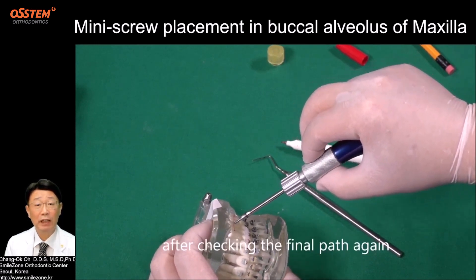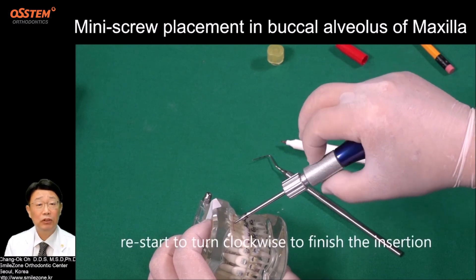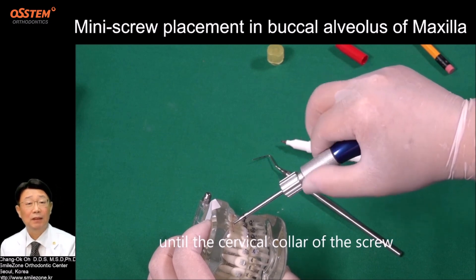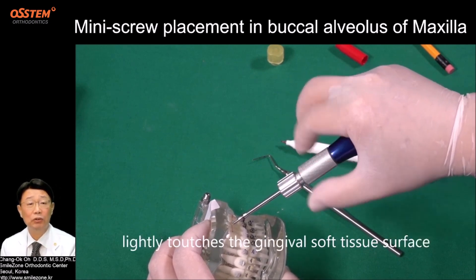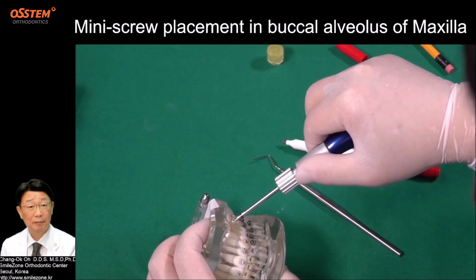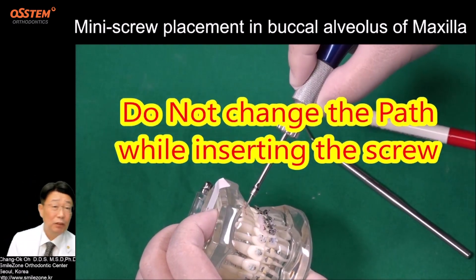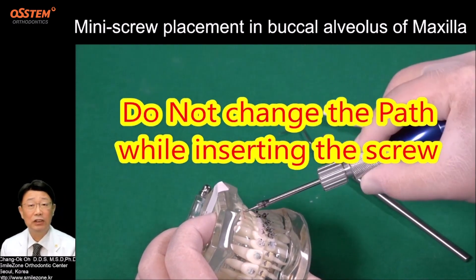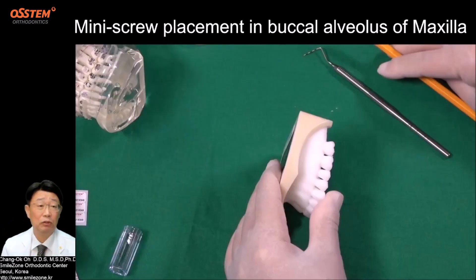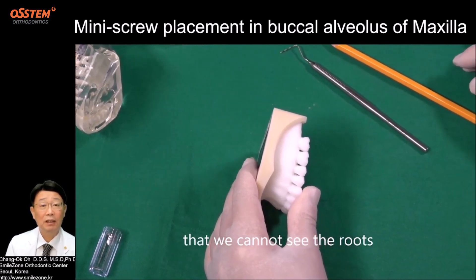After checking the final path again, restart turning clockwise to finish the insertion until the cervical collar of the screw lightly touches the gingival soft tissue surface. Do not change the path while inserting the screw — it can cause breakage of the screw, especially at the tip.